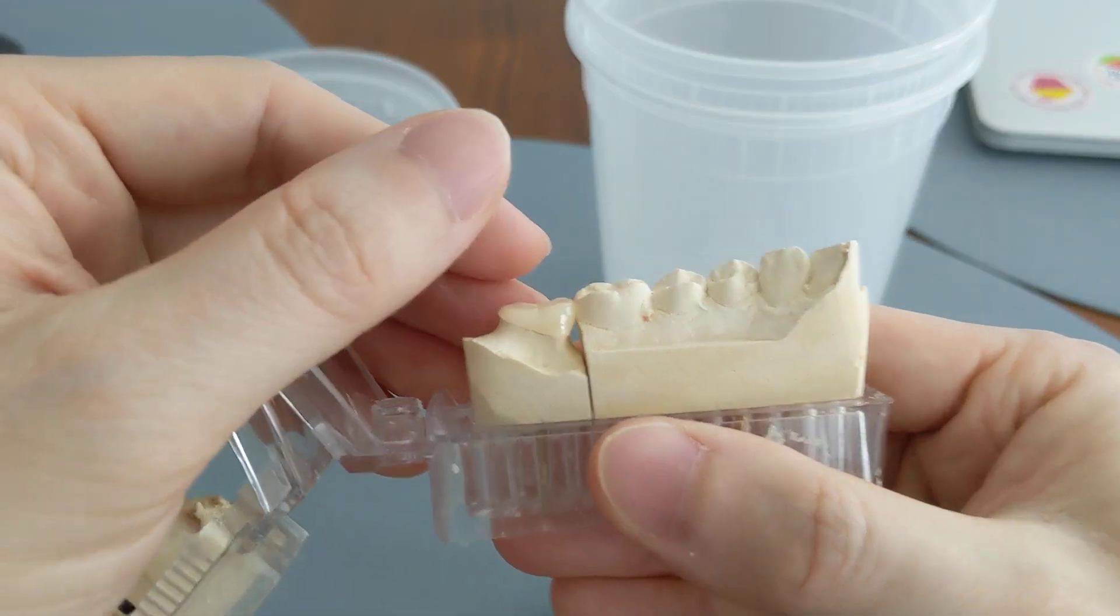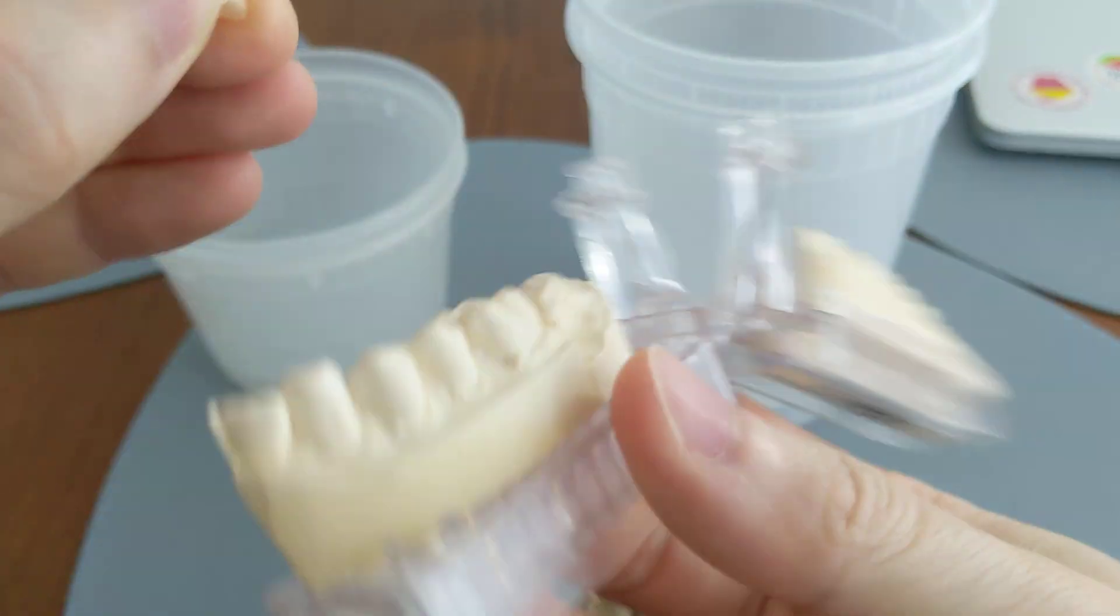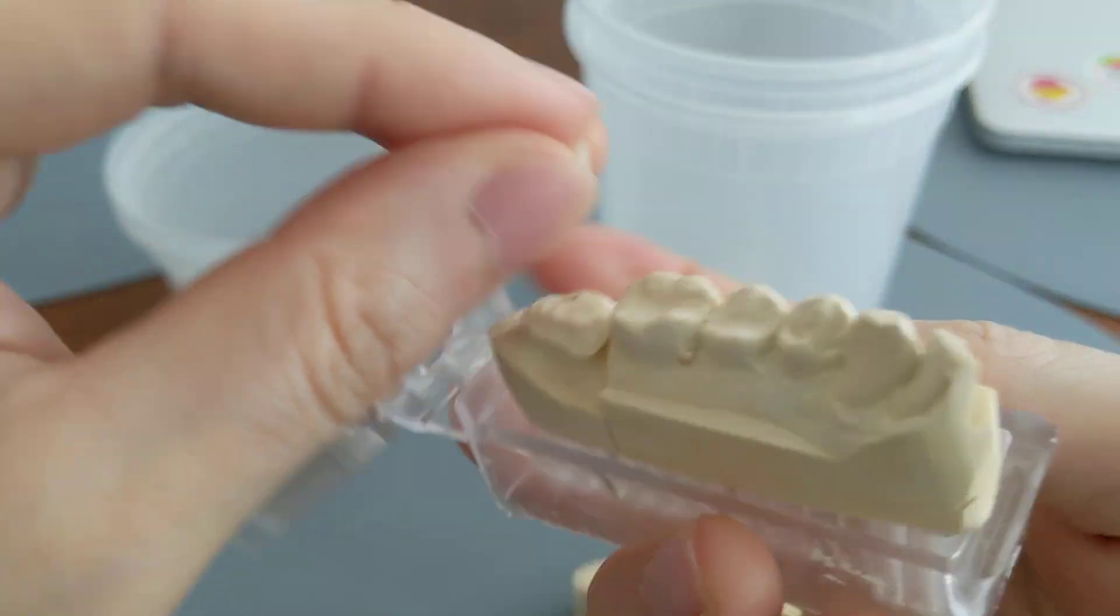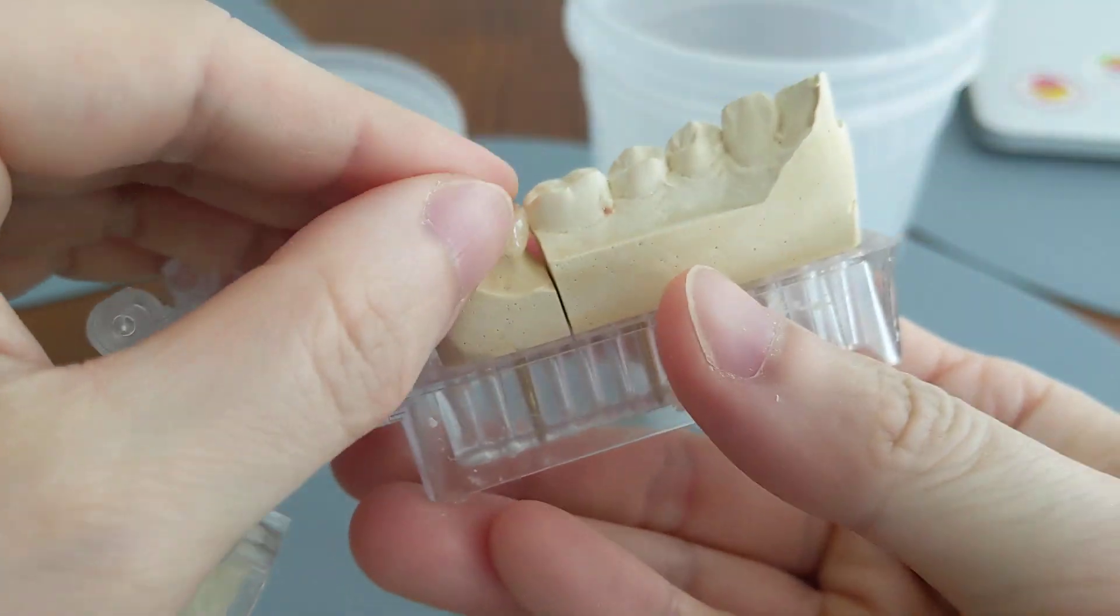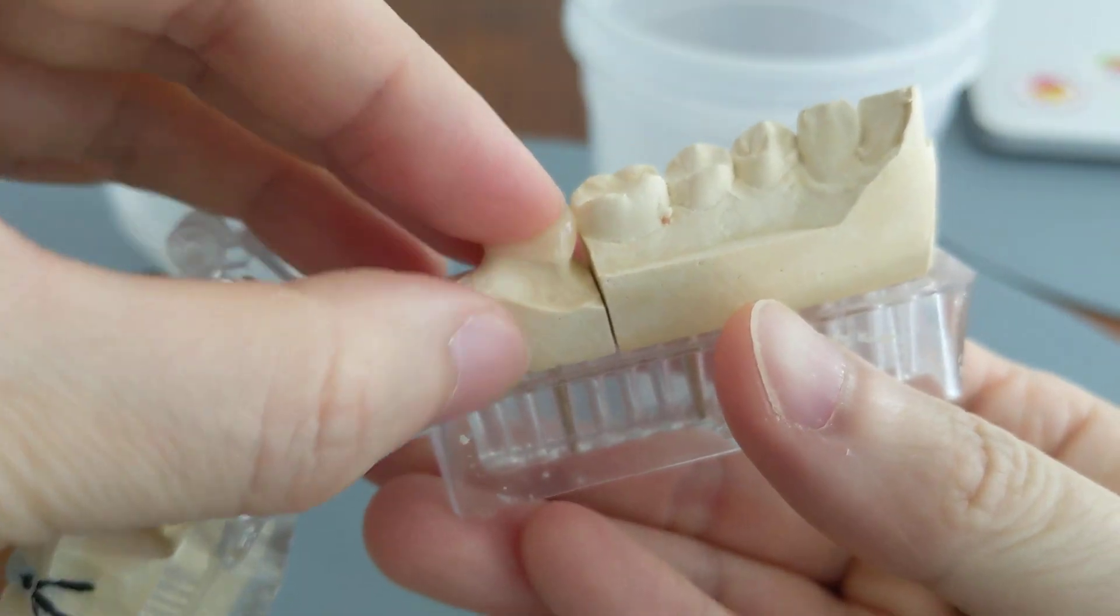So to show you, here we have a crown. You can see it's very short. And because it's very short, it's easy for it to slide off to one side and just pop off.